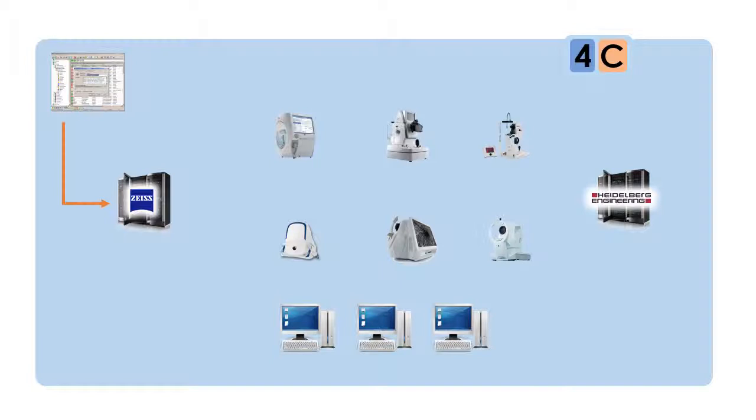That primary ophthalmic PACS then uses the technology called DICOM modality work lists to inform all the devices that it's networked to that that particular patient has arrived, and it passes the patient details to the cameras and scanners. So when a technician takes a patient to one of those devices, that patient's name will already be on the work list for the day, so that patient just needs to be picked off a list and no patient data needs to be manually inputted.